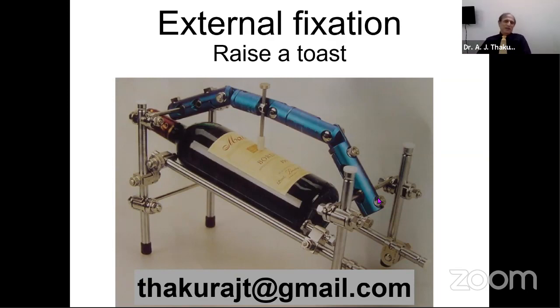And in tibia now, after that paper got published, I stopped using external fixator for a very long time. In a short time, things don't go that bad. If there is a compound injury, we now tend to change it over to something else. But the trick works even in the lower limb as well. One which I treated about 8 years ago, an external fixation from beginning to end, I used the same method and there was no infection. But honestly, the long-term use of pin and rod external fixator for tibia is reduced to quite short-term use.